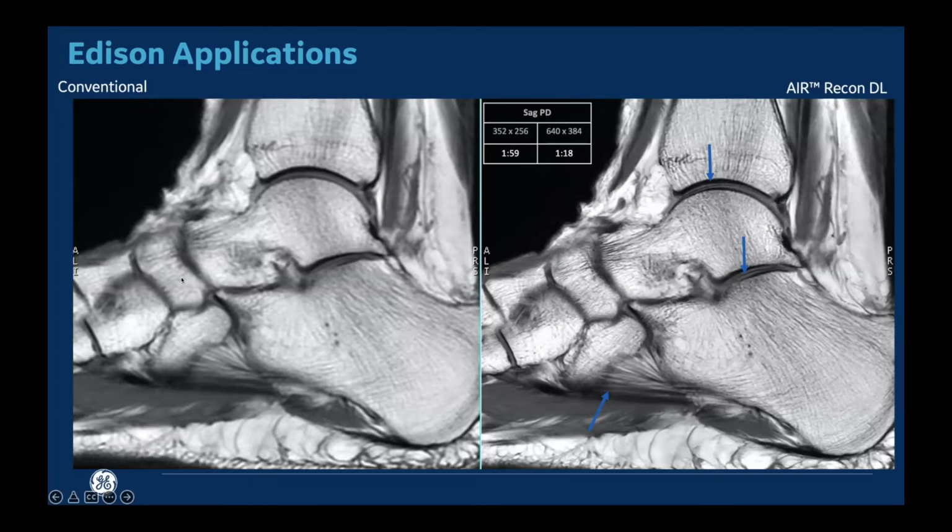And if you see, there is some noise in this image, right? If you think about it from the MR machine, this is a natural process that happens when you output the image. So the question is, can we build an AI that can enhance this image, that can do some reconstruction of this image? And the answer is yes, we can. If you look on the right side, we have this image here with much better quality than this one here. So the radiologist, for example, could spot any abnormality here between left and right.